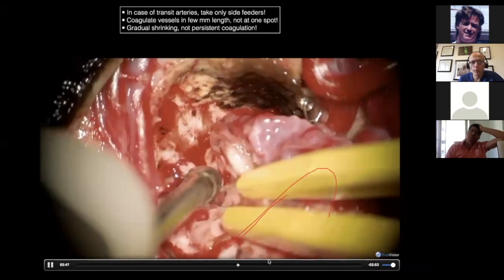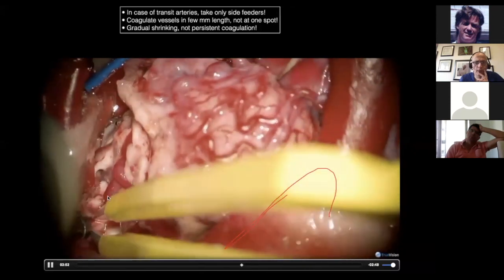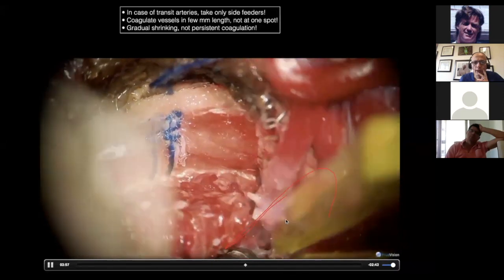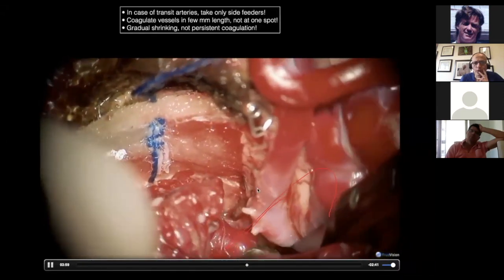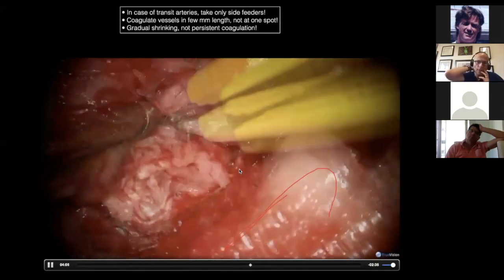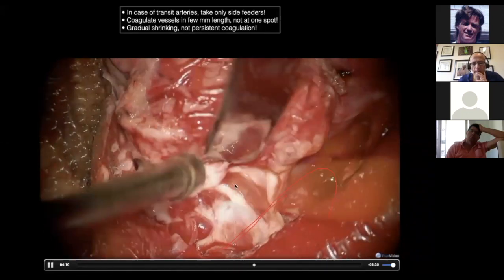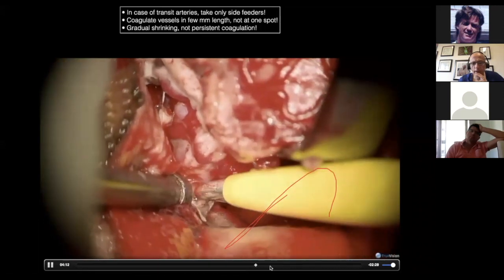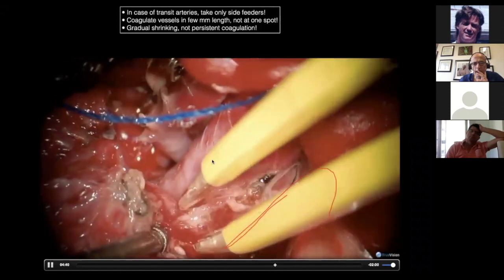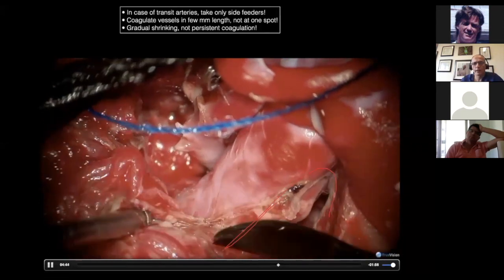See, the AVM is turning blue, softer, then you dive and do the parenchymal dissection. So keep these loops inside, okay? Inside, and this is a normal sulcus. See, I took all these side feeders. This is the draining varix. Retract the AVM, not the brain. It comes, turns around and goes to the normal brain. If you take that, you are taking the normal supply.